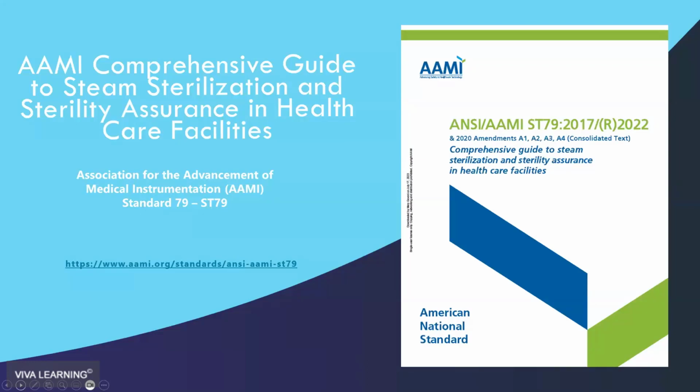So while these are not mandates, they are voluntary standards, this is part of the standard of care, just like guidelines from the CDC are the standard of care.